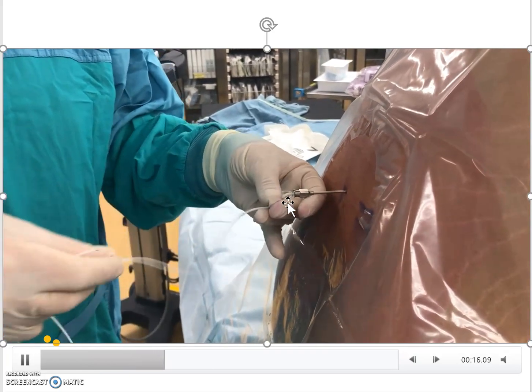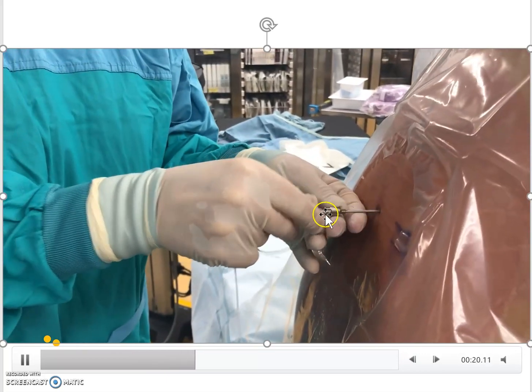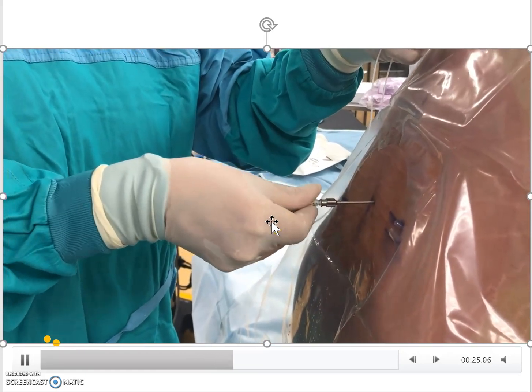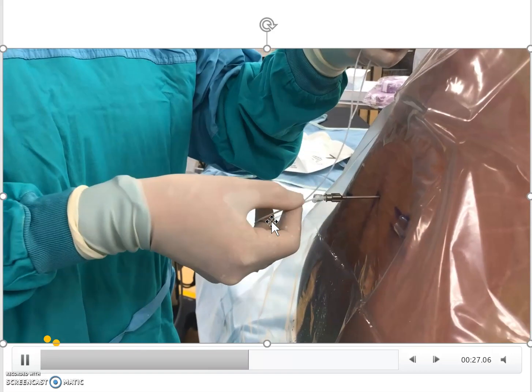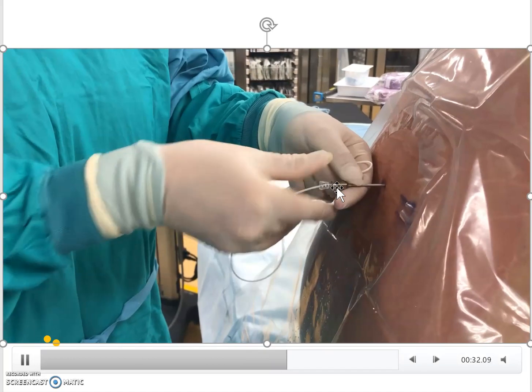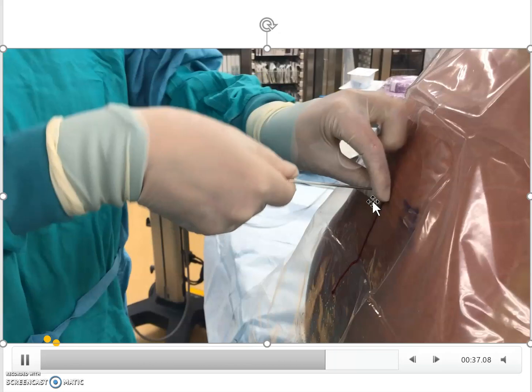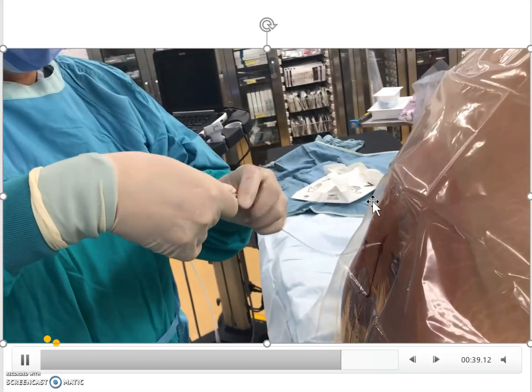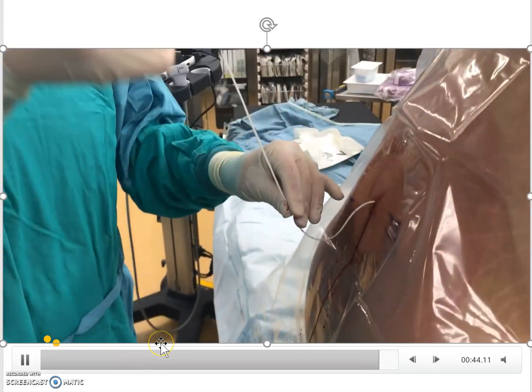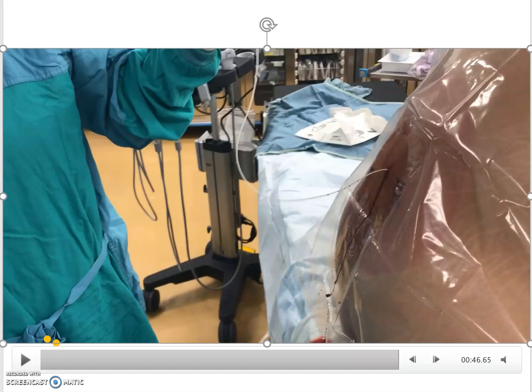At this point you're well beyond the tip of the needle. I usually put in about an extra 10 to 12 centimeters of catheter in addition to what I want in the patient, ending up between the third and fourth marking, because it's very difficult to do counter-pressure on this very flimsycatheter — it almost always just pulls back with the needle. Make very sure that you keep that little pyramid cone piece, because you are going to need it for the next part.